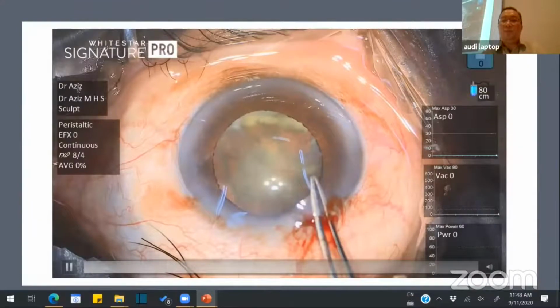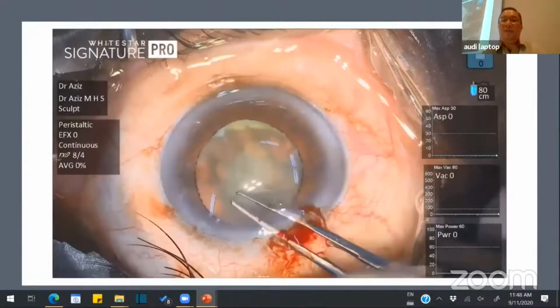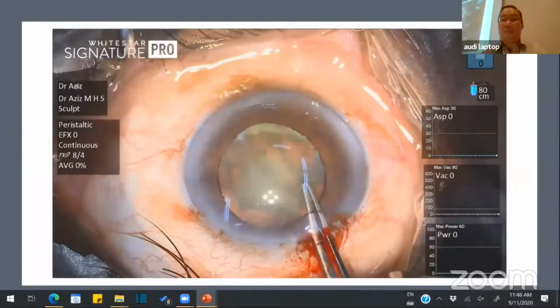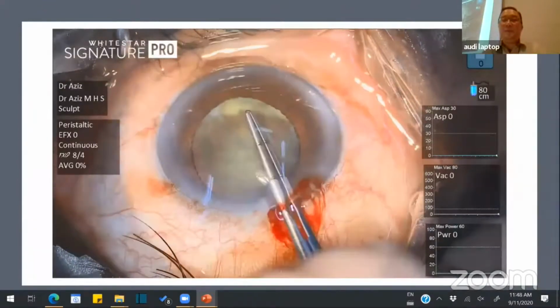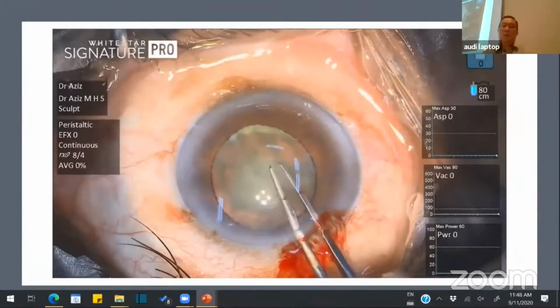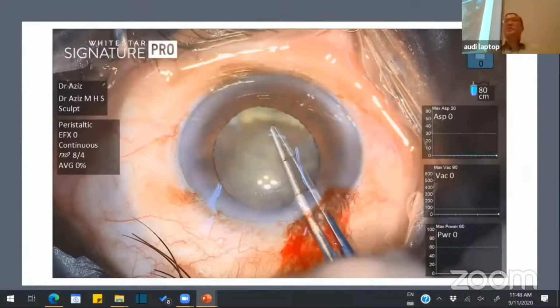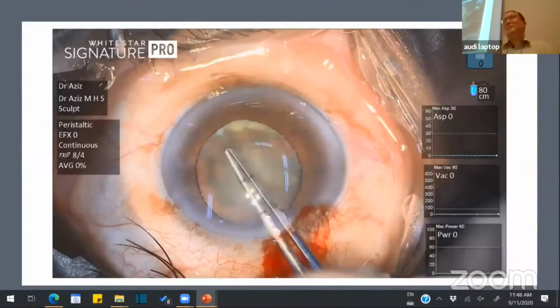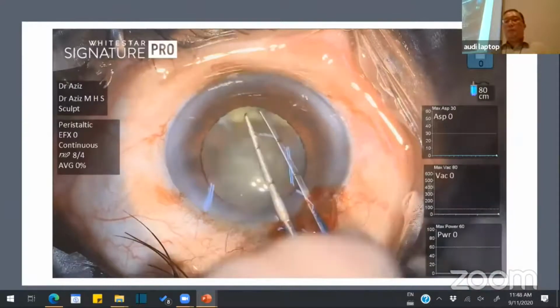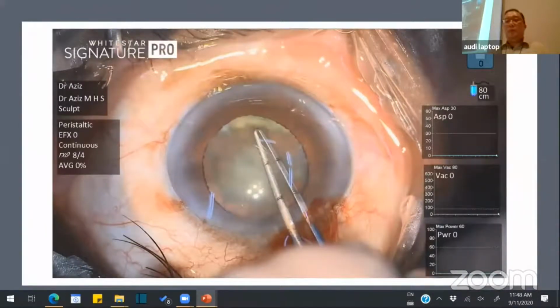So you see the wound, if you have striation, right? Striation meaning you're not positioning yourself correctly, so you reposition yourself. All pull towards the center. There's no issue about your CCC running to the periphery. Right, done.